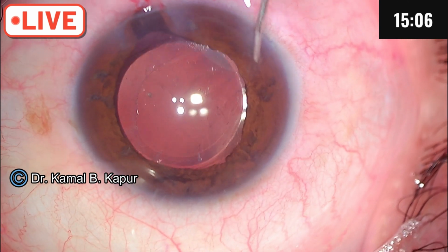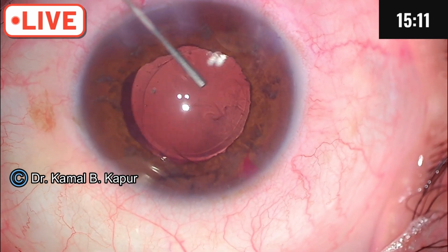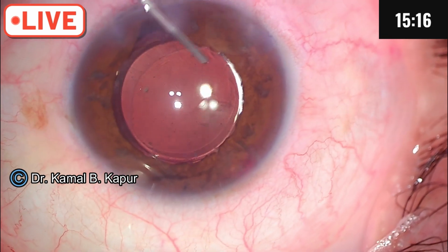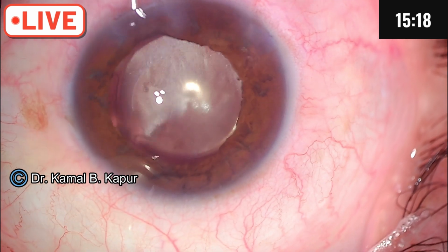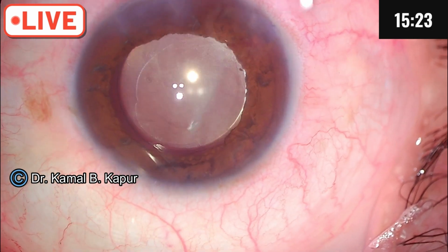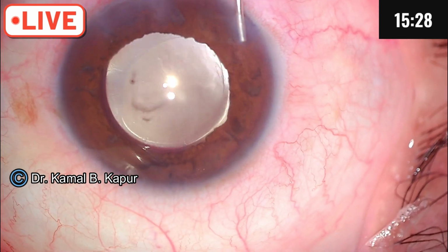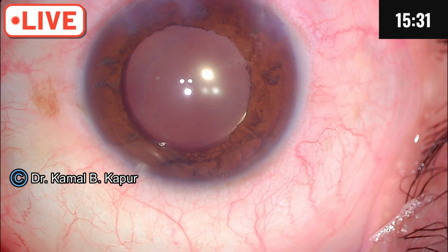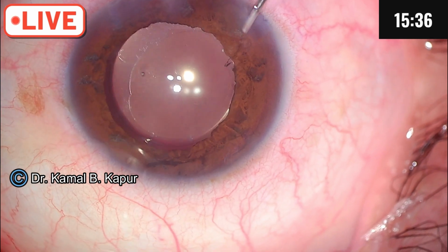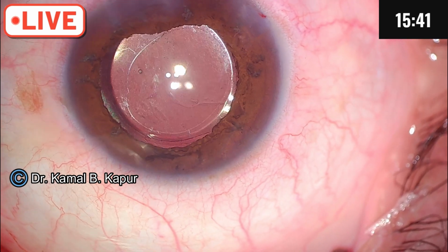So there you are, the surgery is gone off beautifully, and I think we will not need a CTS segment in this case. There is a slight amount of ooze in the iris zone where I pushed it back. ADR. So in case there is a ooze from the iris, you can use some epitrate or adrenaline there in such situations. It tends to stop it.